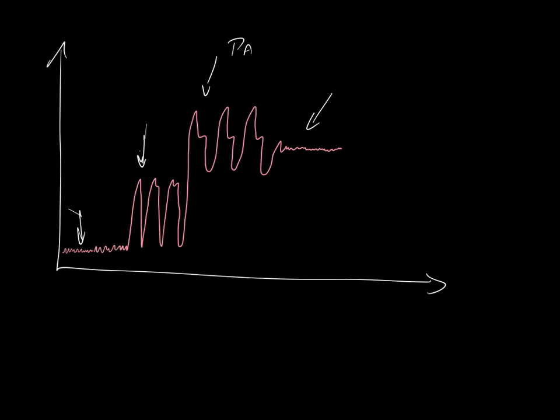How long should we wedge? 30 seconds? 15 seconds, yeah. Absolutely no longer than 15 seconds. How much air do we put in the balloon if we're going to wedge? 1.5 or less. Right, yeah. We don't automatically put 1.5 milliliters. That's the absolute maximum. We only put enough air to cause a change, right? Once it changes to a wedge waveform, we stop, we get the wedge pressure, and we drop the balloon again.